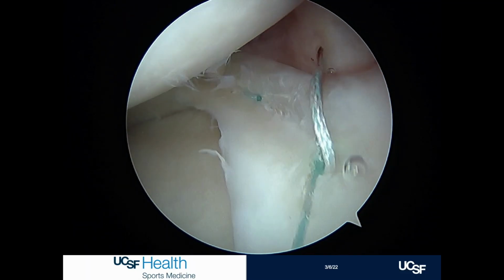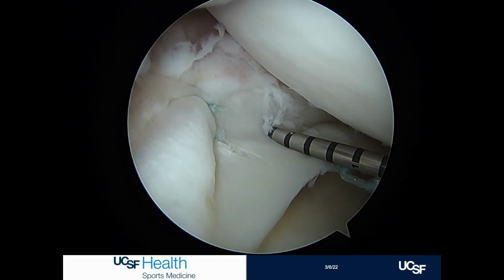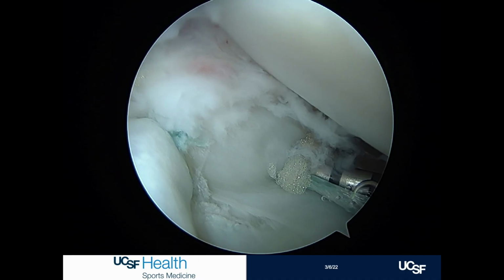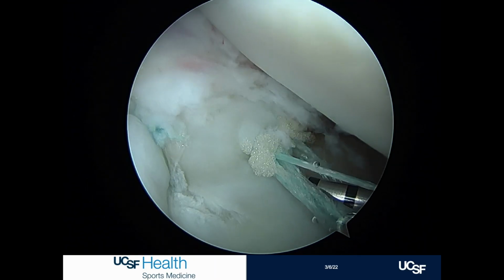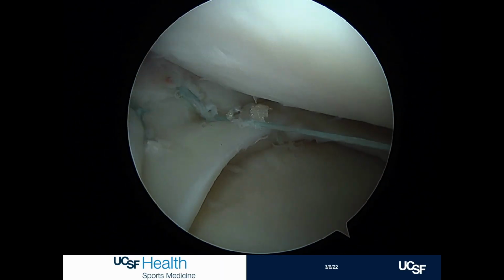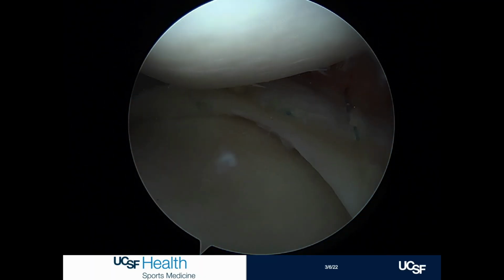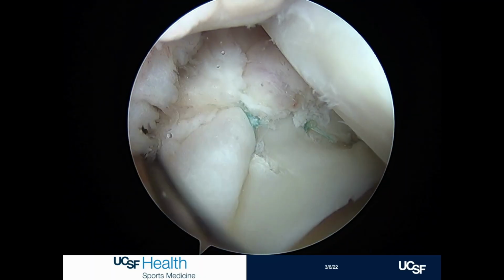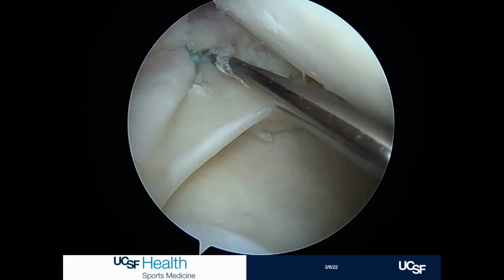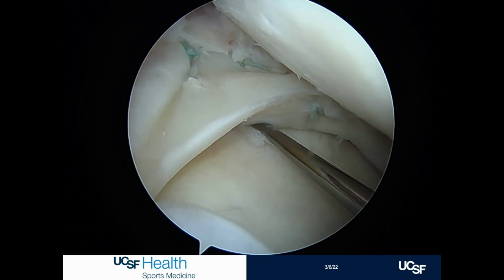Once I had completed that, in this case I actually went back to the ramp lesion section, added an additional suture here to make sure we had that capsular tissue really well held up against the meniscus. And this all came together very nicely. So the final construct, once we had all the sutures in there, approximately half a dozen sutures, very solidly repaired back up to the capsule, the meniscus completely preserved, and the stability of this meniscus very solid up against the capsule there.